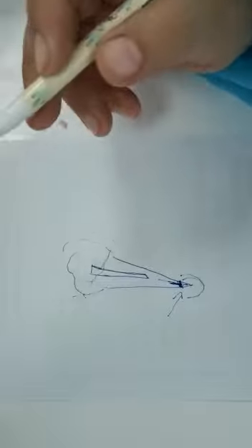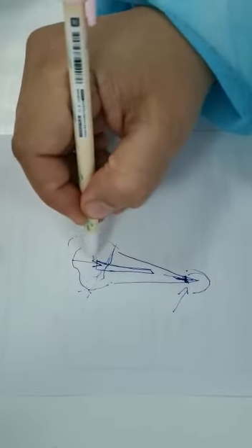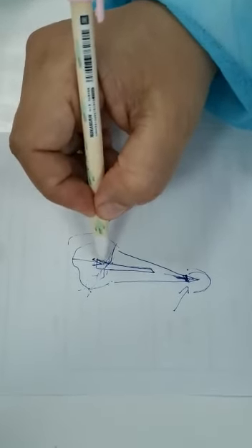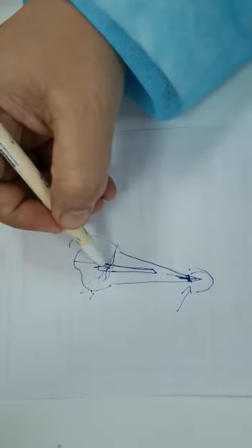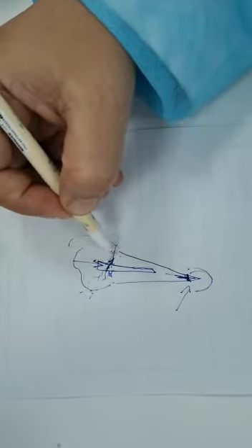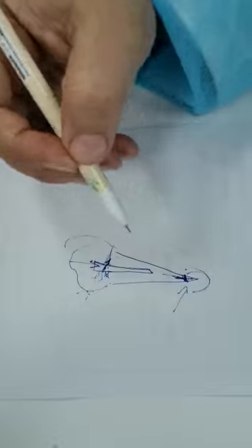But here you have the second case where this is already also broken. If this is also broken, you need to take it out coronally. The problem with doing that coronally is the color and the match. And another thing is the consistency of it. It's close to the dentine. So sometimes you will have a slippage of the instrument while you're going back and forth with the instrument. You keep slipping to the dentine. Many times we'll get a lot of ledges and fractures.